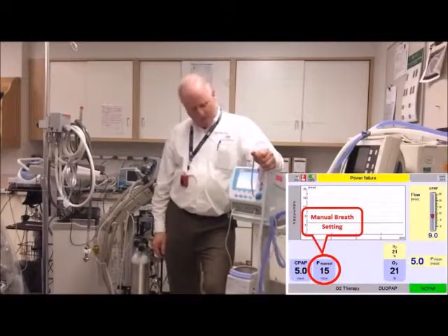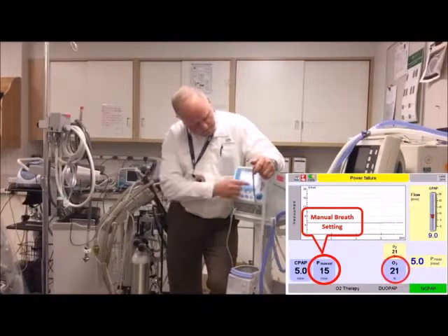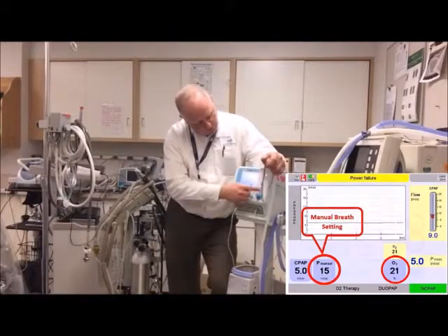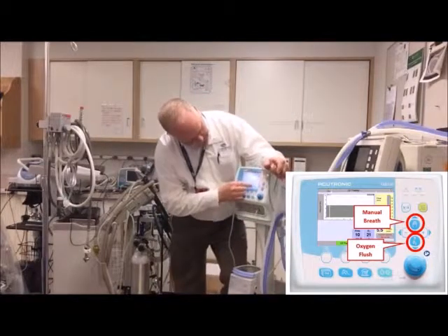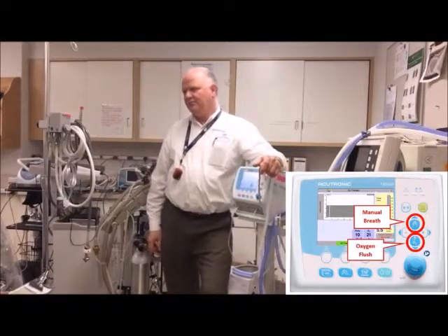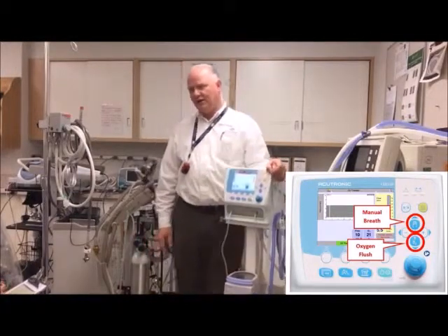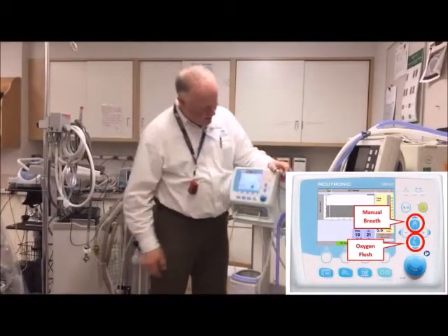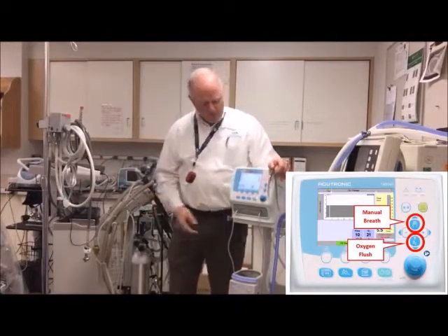We can set our FiO2 to wherever we want. To change the oxygen flush, you push that button — it's set at 48% right now — then dial it to whatever you want and set it. We don't want to give them unnecessary 100% if we're running at 95%. To turn the oxygen flush off, push the button again or it'll time out.